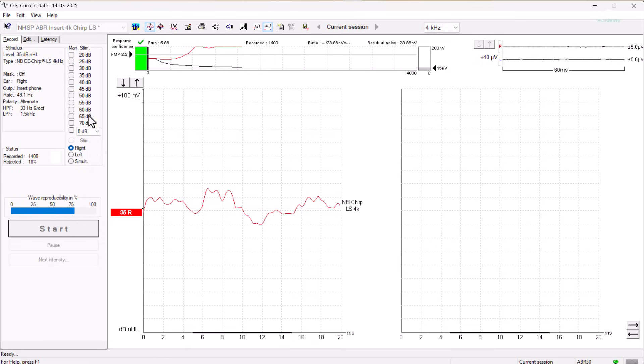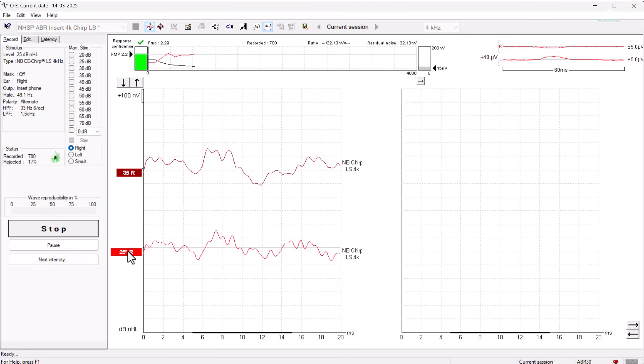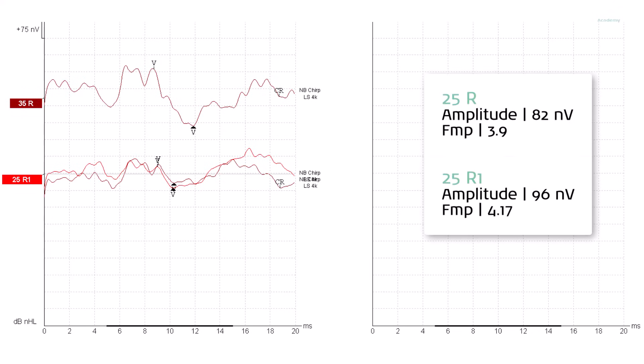From here, the level was decreased by 10 dB down to 25 dB NHL, which corrects to 30 dB EHL for this baby — our discharge criteria. At 25 dB NHL, another waveform with the expected morphology was elicited. It follows the anticipated latency shift and amplitude reduction compared with the level above, and the FMP value has also been achieved. As this is the level of our discharge criteria, a repeat waveform was run next. We can see repeatability in the second waveform compared with the first, and although there is some noise between the two waveforms, this does meet the 3 to 1 signal-to-noise ratio criteria required to categorize this level as a CR.